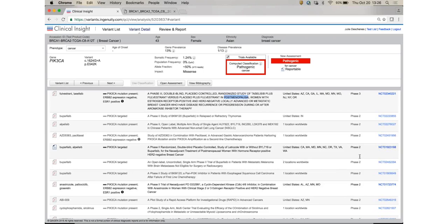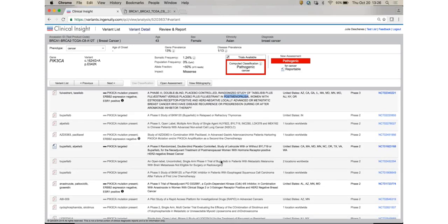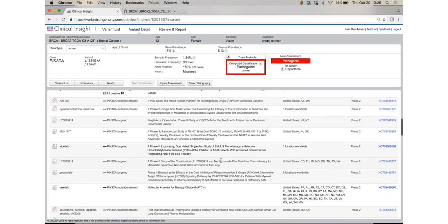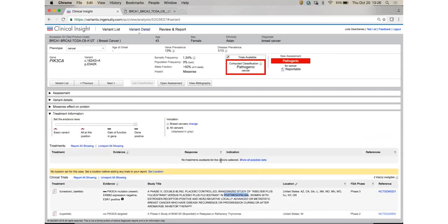You always have the phase of the trial. One thing to take into account is that all of these trials are currently enrolling, so they will accept new patients. And then you have the clinical trial record that you can always link out and see. My colleague has done all the exercise of looking into that and identifying potential clinical trials that are meaningful for this particular case.